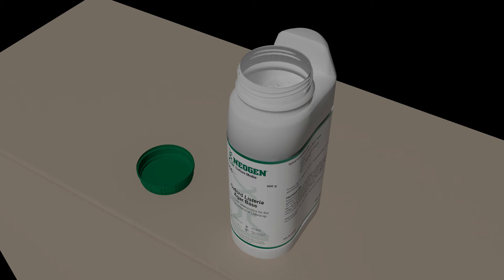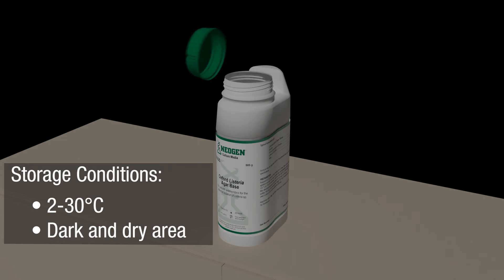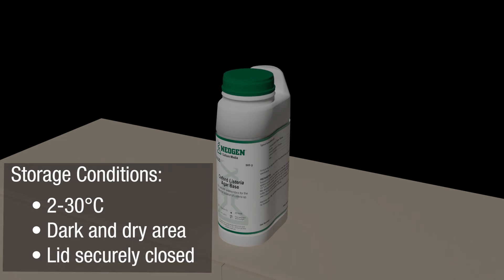The majority of DCM products, unless stated otherwise in the manufacturer's instructions for use, should be stored between 2 and 30 degrees, in a dark and dry area with the lids closed securely to prevent moisture getting in.